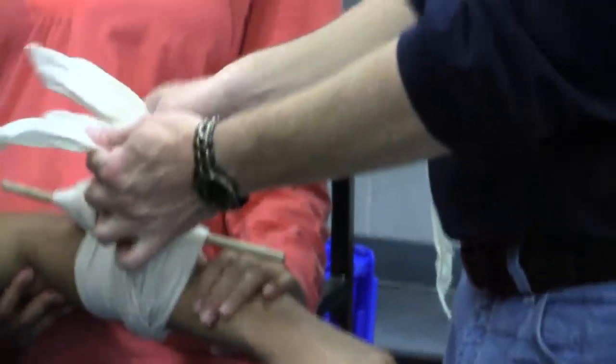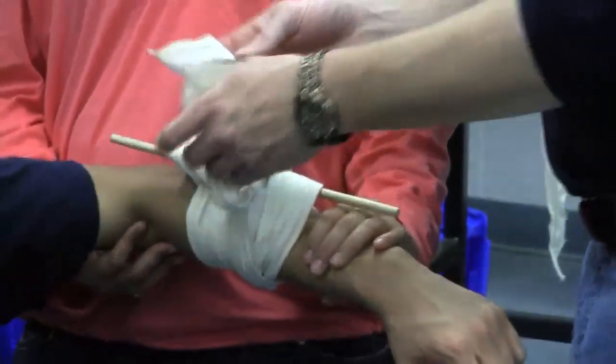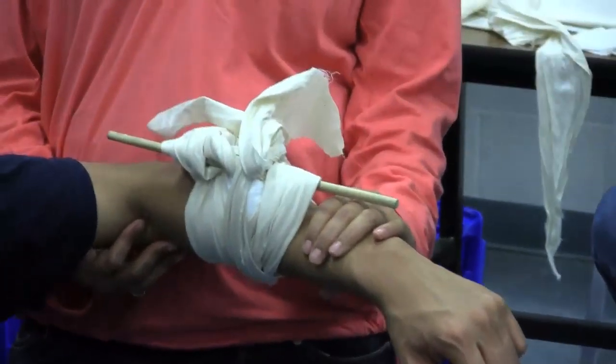What else do we want to do once we've placed a tourniquet? Write the time. TK — write TK on the forehead. That's the only way it's really going to be set and communicated clearly. Easy enough.